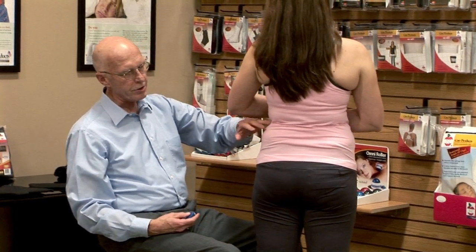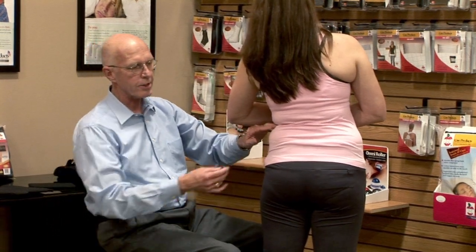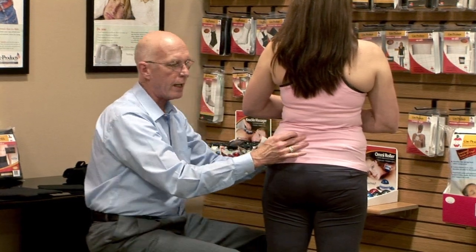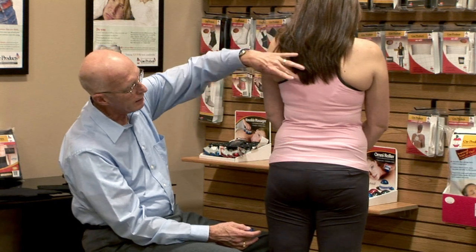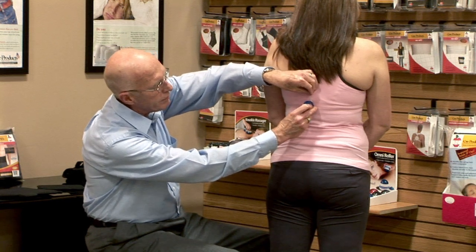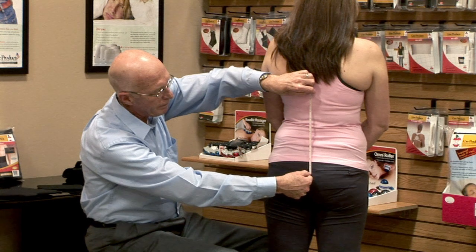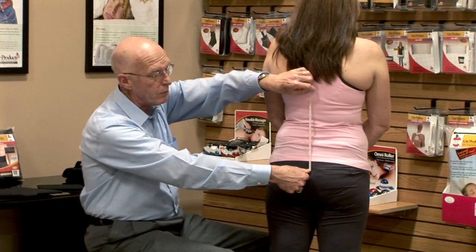If there's an issue locating the waistline, just have the patient do a lateral bend — you'll see the crease form there. That's the natural waistline, so get a circumferential measurement there. For the posterior height measurement, come from the inferior angle of the scapula to center spine and come down two inches. From that point, get a length measurement down to the distal margin of the sacrum.